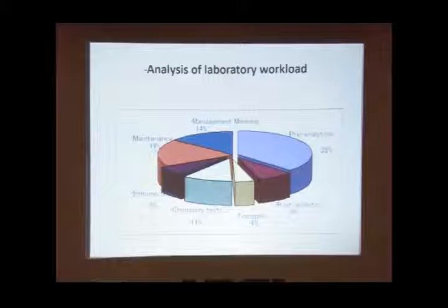Transport takes about 4% of our time. Then chemistry and immuno takes about 15 to 16% of our time. And maintenance takes about 19%, and management meetings and others. This is just a rough estimate of how our time in the laboratory is spent.